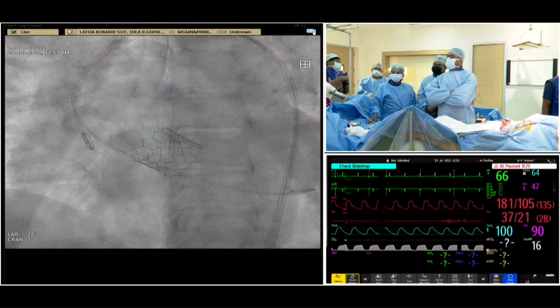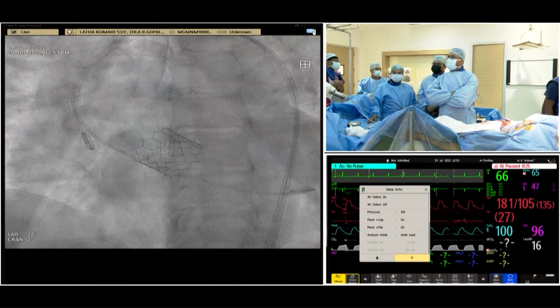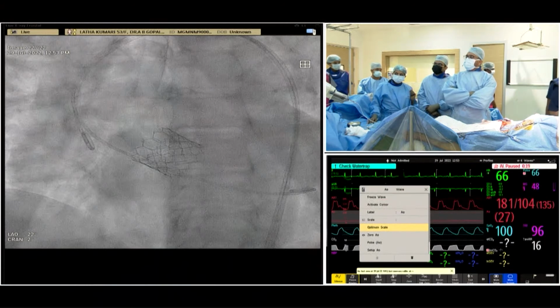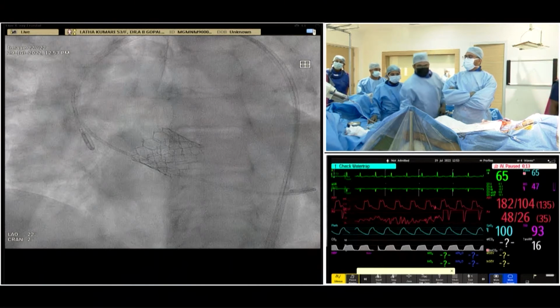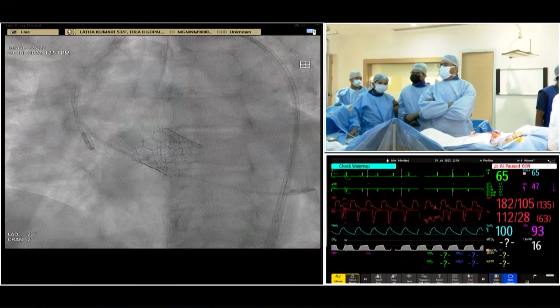Dr. Pratap, you said you would not do a pre or post dilatation in this case. That was your first comment. But finally, you did a post dilatation, so immediately you saw mild regurgitation, and you thought you'd just do a dilatation immediately and created an excellent result at the end. Yeah, of course, the intention is not to post dilate, but when there is a necessity, I do it. Yeah, absolutely.